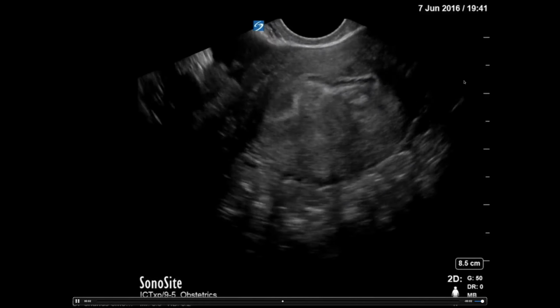Next thing we're going to do is survey the adnexa. We've identified the uterus, we've swept through, and the uterus appears empty. We looked outside the uterus for some free fluid, we found some, and now we're going to do our adnexal survey. Like I already told you guys, when we're surveying the left adnexa, as in this case, we're going to put the uterus on this side of the screen.